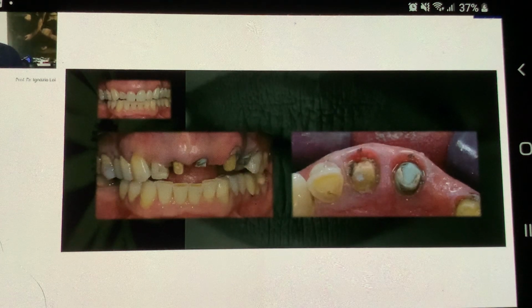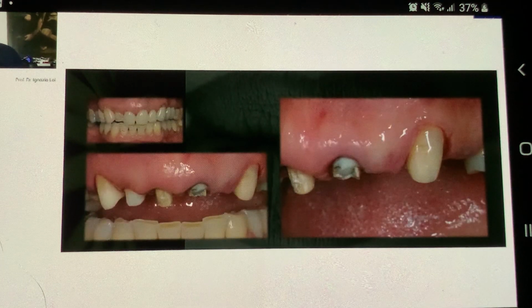There were alterations on the surface which were not clearly identifiable and understandable through the probe. So I didn't have good, smooth walls beyond a finish line. I had a series of issues that were difficult to identify.